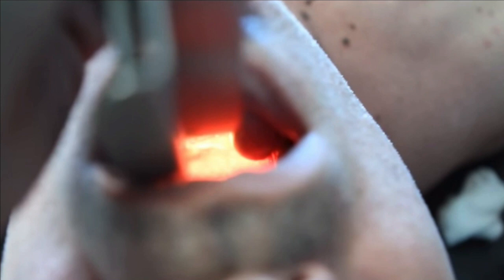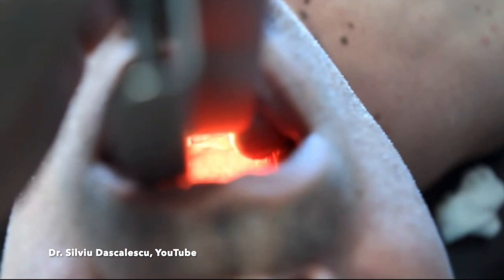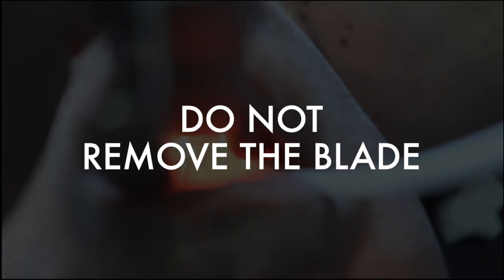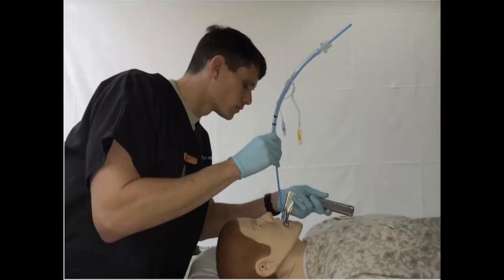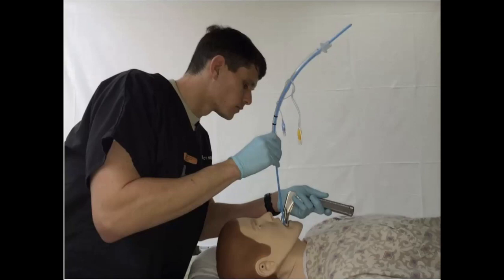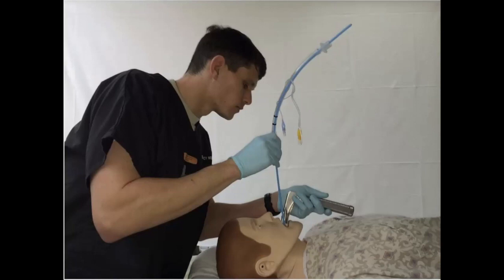In this video, we don't have a great view but we can see the epiglottis — a prime indication for the bougie. You can see the bougie snaking anteriorly toward the airway. At this point you're feeling for tracheal rings, inserting gently until you hit resistance. Stop, keep your view, don't take the blade out, and then railroad the ET tube over the bougie while someone holds it at the top so you don't bury it down into the lungs.